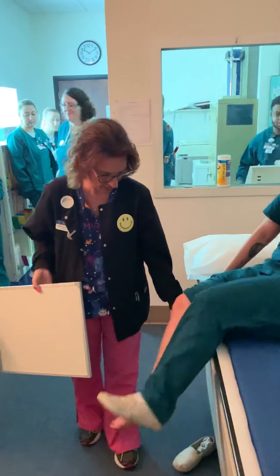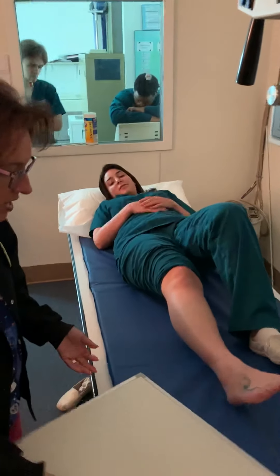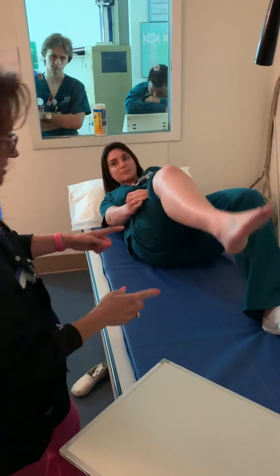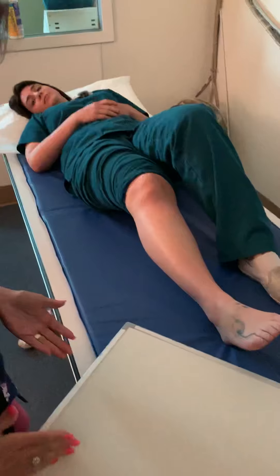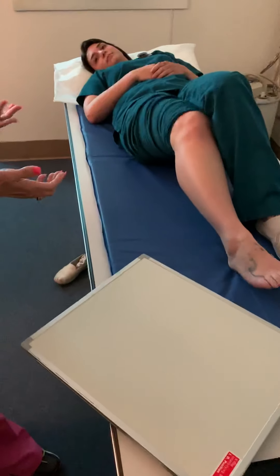We'll let you go ahead and lie back. Most adult patients, the tibia and fibula won't fit lengthwise, so most adult patients you're going to go corner to corner on the IR with a digital receptor.